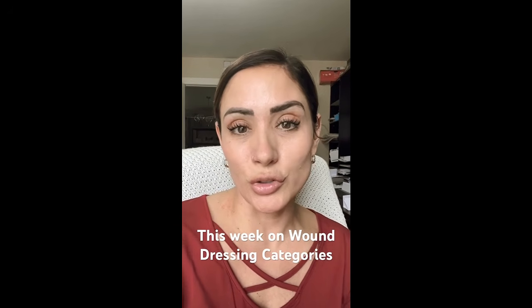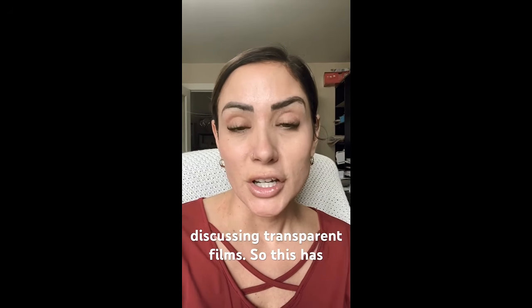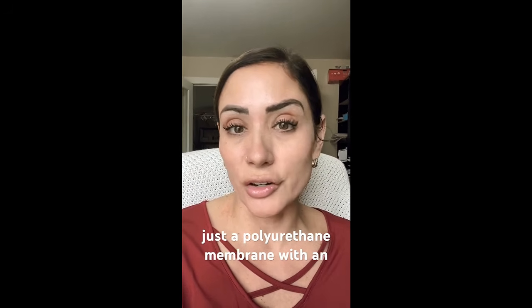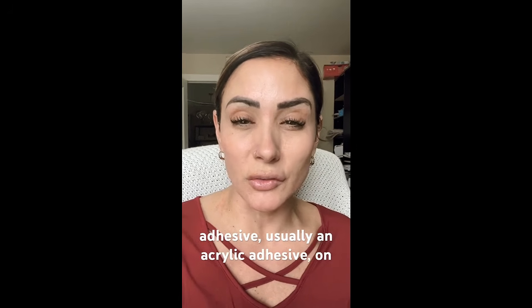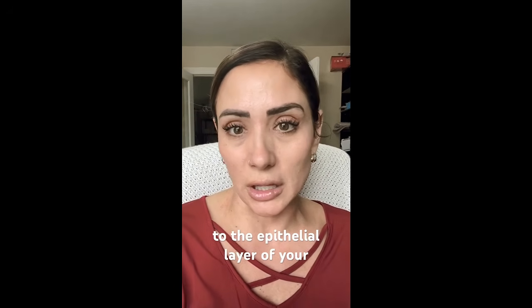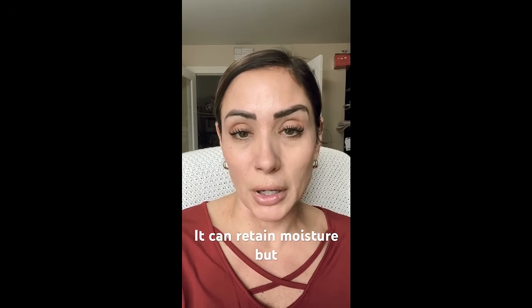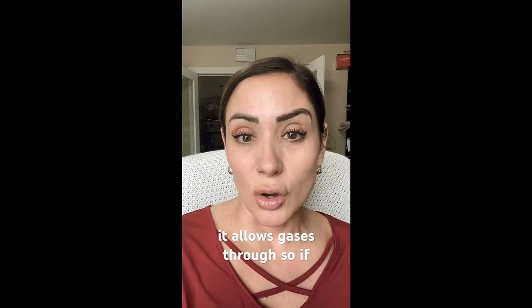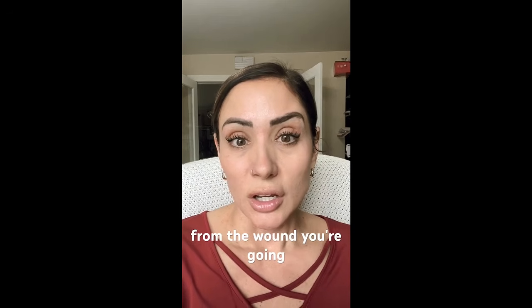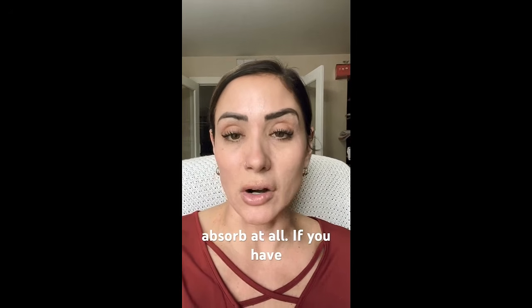This week on Wound Dressing Categories with Lizzie, we're going to be discussing transparent film. So this has no ability to absorb anything. It's just a polyurethane membrane with an adhesive, usually an acrylic adhesive, on one side of it that sticks to the epithelial layer of your skin. It can retain moisture, but it allows gases through. So if any exudate is coming from the wound, you're going to see it collect underneath. It's not going to pass through or absorb at all.